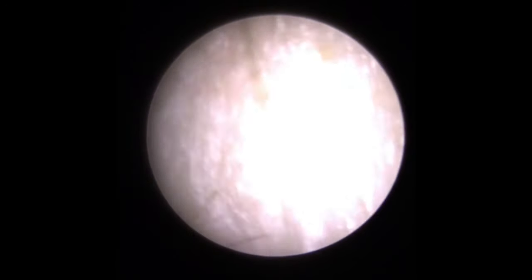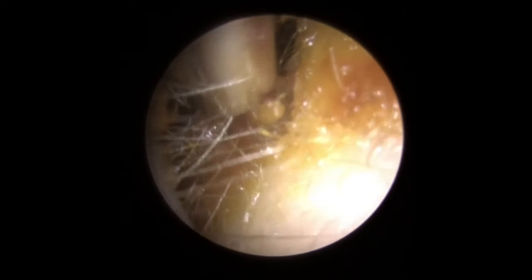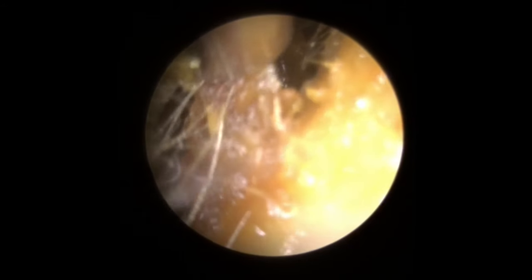So on to our second patient in the compilation. You can see now we've got a little bit softer wax — still quite blocked up in here. So we're going to adopt a little bit of suction here. We're going to clear this entrance first of all — just get this little bit away from the front end there. You can see how sticky that is — just peeling away from the canal walls. And then we're going to aim for that larger rear section now, see if we can get a good grip. It's a little bit softer than the first patient's.